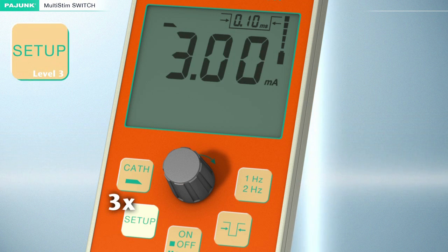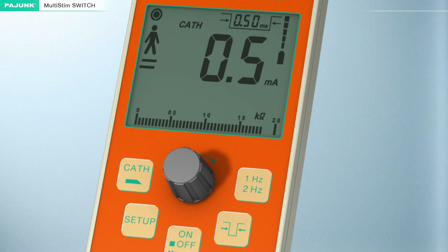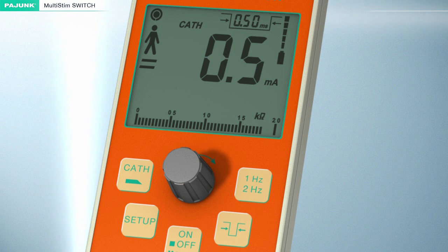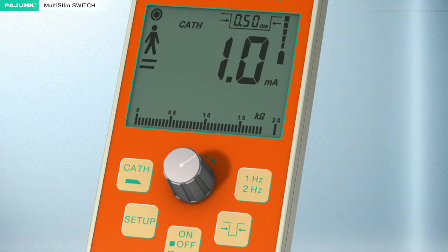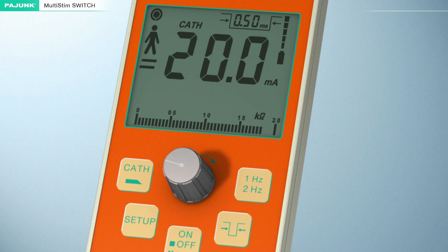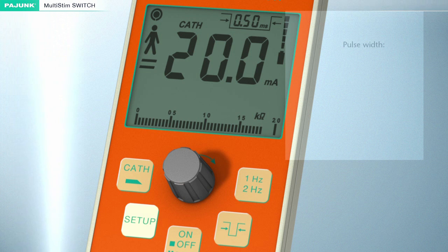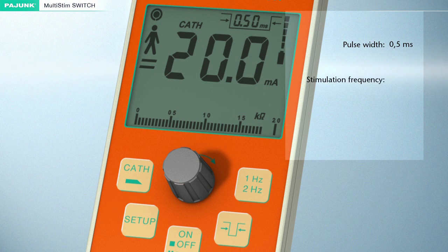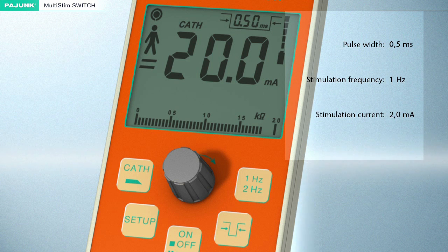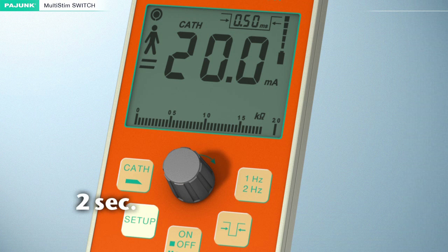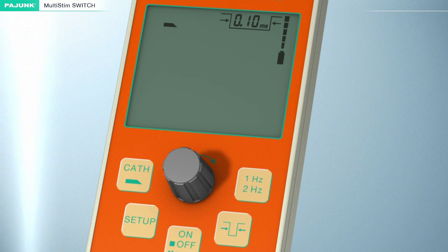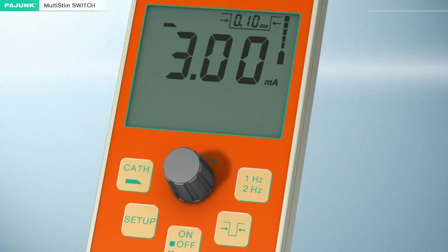Setup level 3. The catheter mode can be adjusted in level 3. Individual stimulation parameters differing from the manufacturer's default settings can be defined. The settings for the frequency and the impulse bandwidth must be adjusted in normal operation, before pressing the setup button for the first time. The intensity of the current can still be varied in the setup function by turning this knob. The factory settings for the catheter mode are: pulse width 0.5 milliseconds, stimulation frequency 1 hertz, stimulation current 2.0 milliampere. The setup button must be pressed for at least 2 seconds to permanently store the values. A monitoring sound will be emitted upon successful storage, then the device will switch to pause mode automatically.